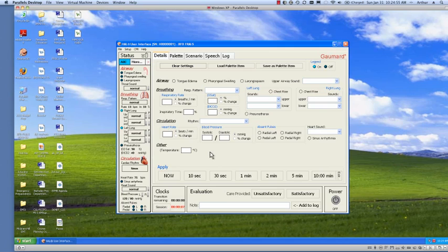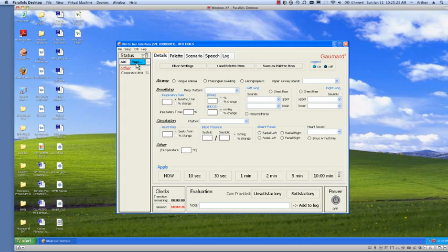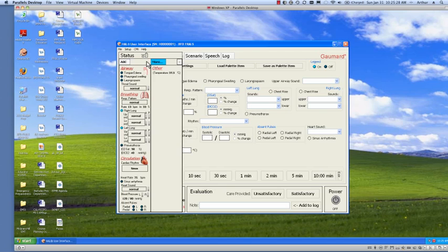So just as a reminder, here on the left is the control viewing point. So basically, you'll notice that here it's blank. All of your information is here on the left. So normal lung sounds, no pneumothorax, for example. The default rhythm is a sinus rhythm at a heart rate of 75. Blood pressure is 120/80. If you wanted more information, you can click there, and it will tell you that the body temperature is 37.5. And so you can also open it in this direction as well.